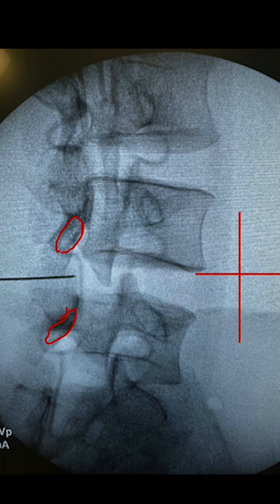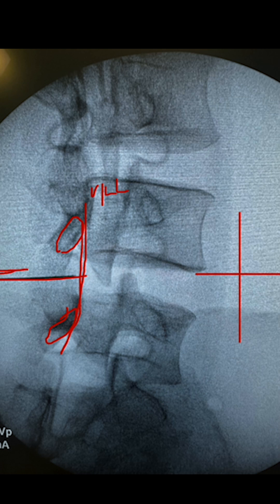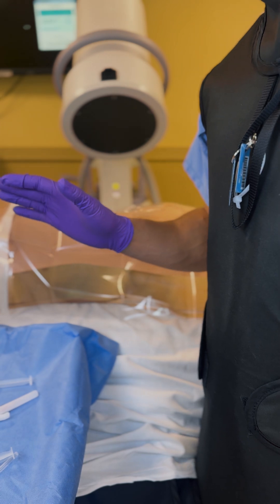On this CLO image we can identify the lamina and, importantly, the ventral interlaminar line — the VILL — which is a theoretical line approximating the ventral margin of the lamina. Our needle is already fairly advanced, but this view is used for advancing the needle. Typically the needle starts further out, and we use this image to understand how far to advance to approximate the ventral interlaminar line.